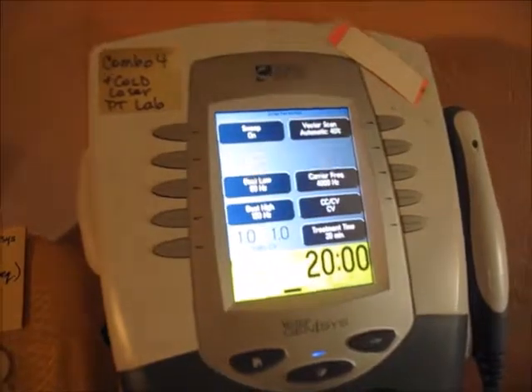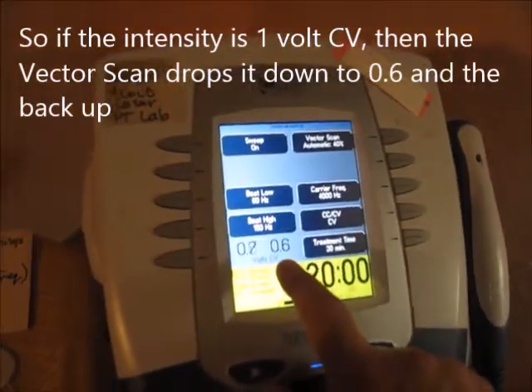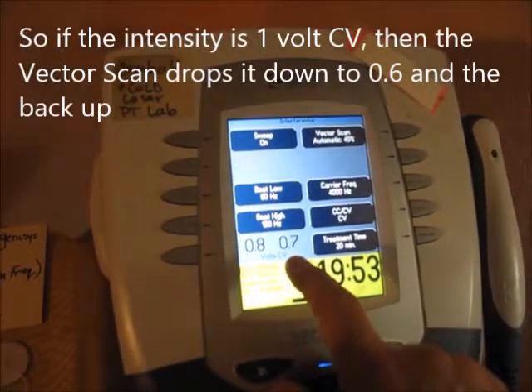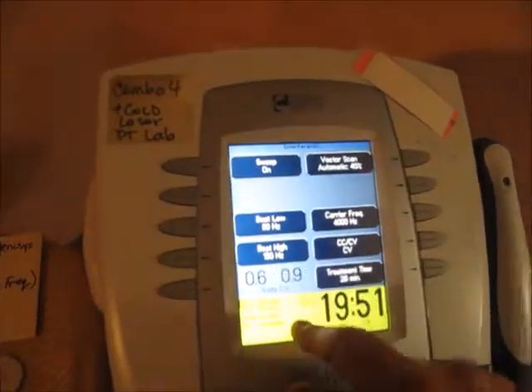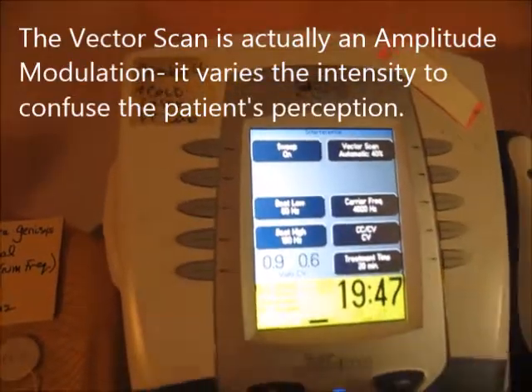If you set intensity to 1 volt CV and hit start, you'll see these numbers go up and down — they'll go no lower than 0.6 because that's 40% of 1. That's how vector scan works: it's an amplitude modulation.